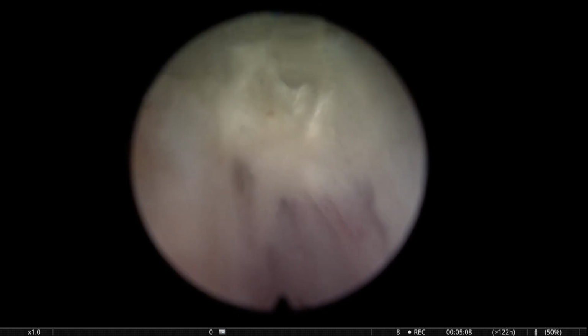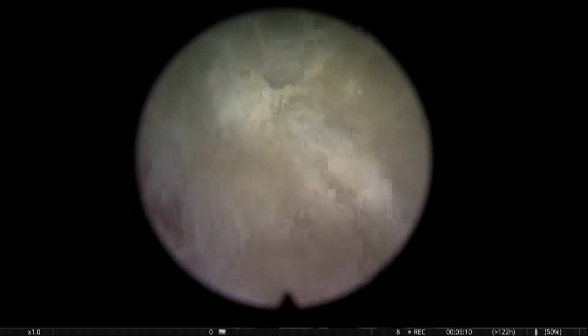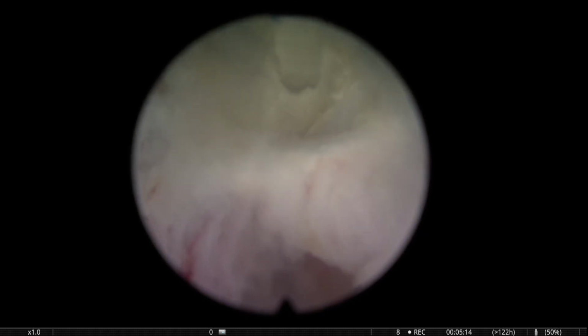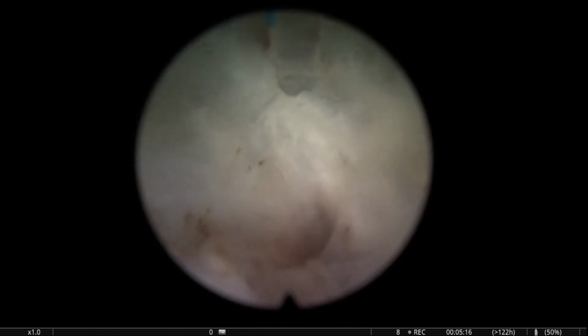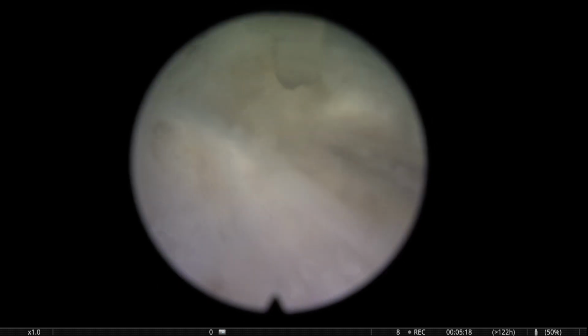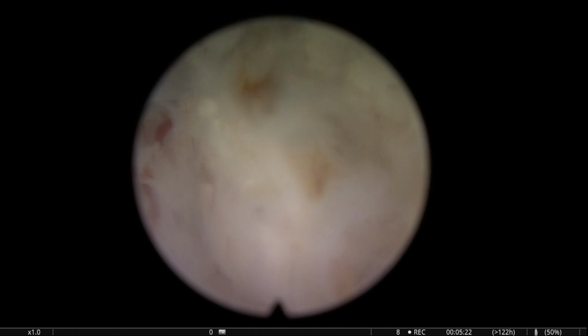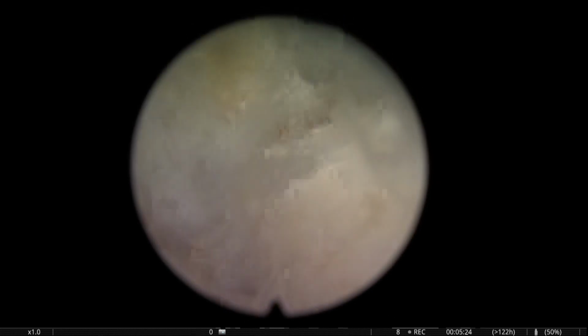is sometimes not easy to recognize, and specifically if you look at a single frame, if we stop the video in one moment and we look at a photo, it's very, very difficult to say this is capsule and this is adenoma. Many times you see that's the yellow aspect of the adenoma.